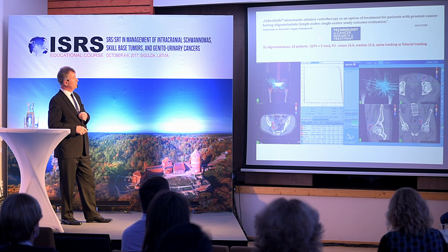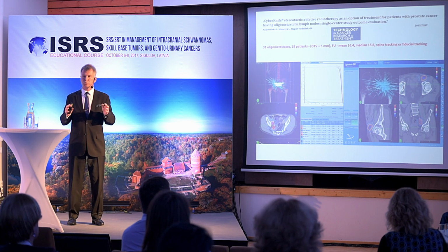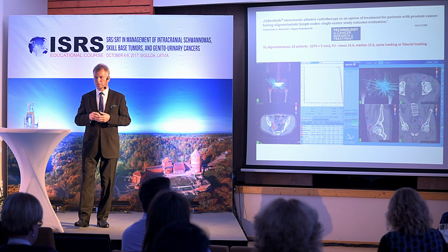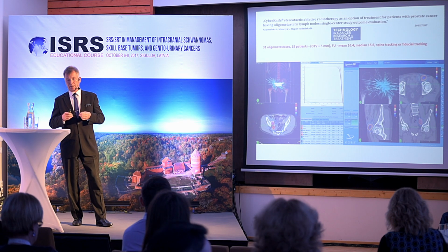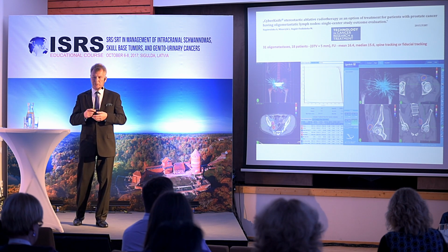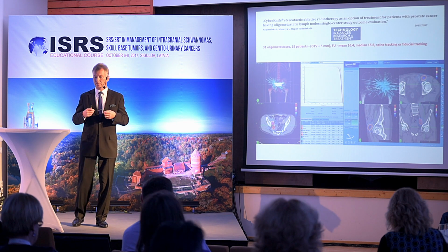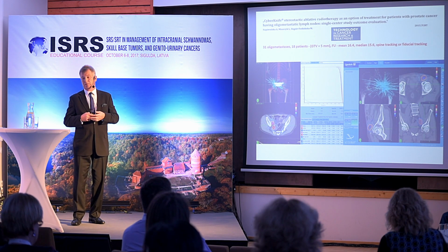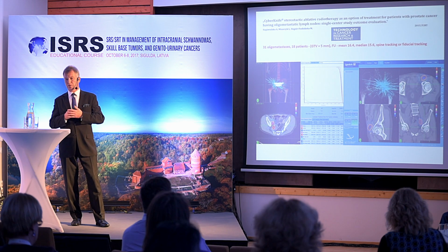So we delivered those for GTV plus margin. There was some discussion about margins, and I absolutely agree that when we talk about intracranial location, sometimes we can skip the margin. It's a stable situation. And when we treat a moving target, I'm thinking about the breathing mobility, sometimes it's more than 2 centimeters, and we must use Synchrony, we must take into account some margin. So this is the first reason, and the second reason for the margin is the subjectivity of imaging assessment. In simpler words, I do not believe in the very high precision of CyberKnife, and secondly, I do not believe in my contouring.